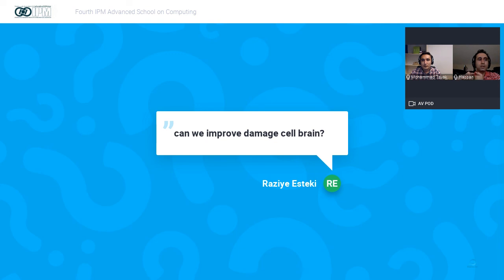Application two is drug delivery in the brain. For any type of cancer, we can do chemotherapy, but for brain cancer, we can't because of the blood-brain barrier. The blood-brain barrier prevents big molecules from escaping the blood into the brain tissue. So what we do with ultrasound is excite around the tumor so that we disrupt the blood-brain barrier, the gates open, and then the chemotherapy agent can go to the tumor, and it will be targeted chemotherapy. So you only target the tumor.